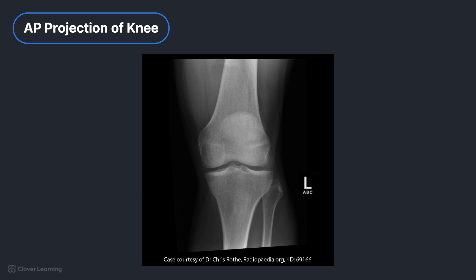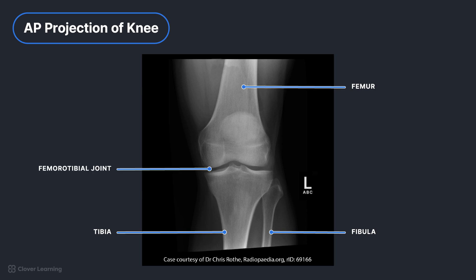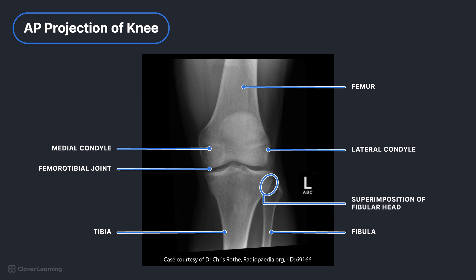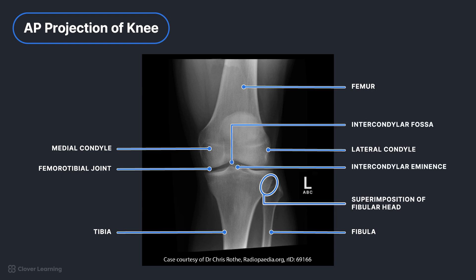We can tell this is an AP because the distal femur and proximal tibia and fibula are shown. The femorotibial joint space is open, with the articular facets of the tibia seen on end, with only minimal surface area visualized. It is a true AP with no rotation, as evidenced by symmetric appearance of femoral and tibial condyles in the joint space. The medial half of the fibular head is superimposed by the tibia, and the intercondylar eminence is seen in the center of the intercondylar fossa.